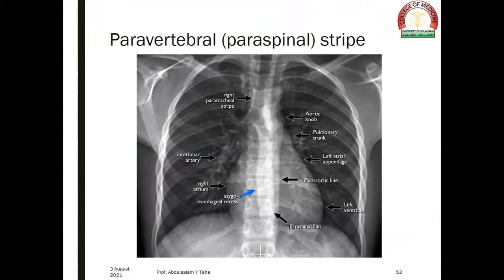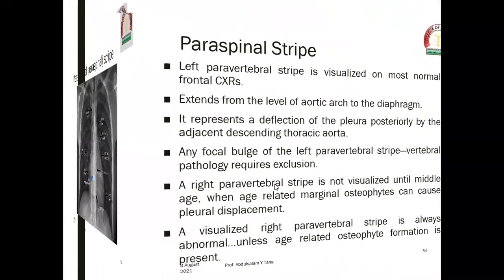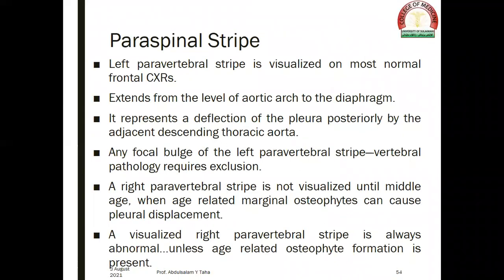The paravertebral or paraspinal strip may also be visible on x-ray. The left paravertebral strip is visualized on most normal frontal chest x-rays, extending from the level of the aortic arch to the diaphragm. It represents a deflection of the pleura posteriorly by the adjacent descending thoracic aorta. Any focal bulge of the left paravertebral strip indicates vertebral pathology. The right paravertebral strip is not visualized until middle age, when age-related marginal osteophytes can cause pleural displacement. Therefore, a visualized right paravertebral strip is always abnormal unless age-related osteophyte formation is present.